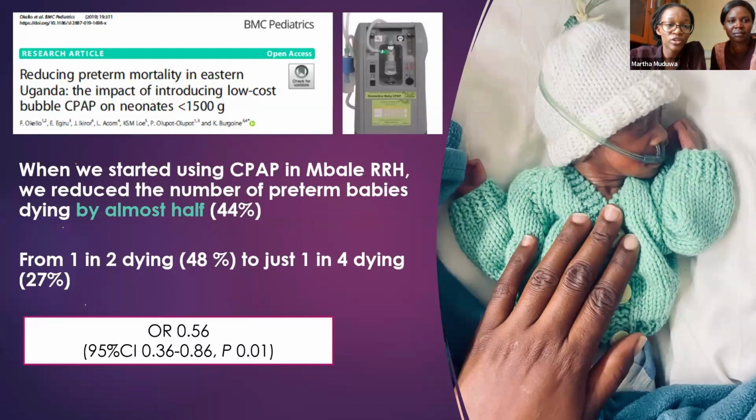We found that with introduction of this low-cost CPAP locally, we reduced our deaths of preterm infants, so very low birth weight infants, by almost half. Before we had about 50% of them dying, and that was reduced down to 27% with the introduction of CPAP. And I believe with further improvement in the neonatal care, those numbers keep going down.